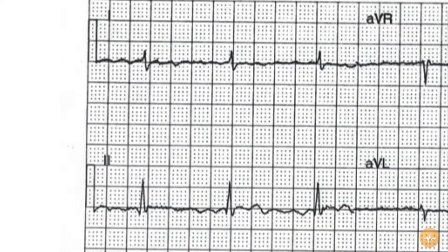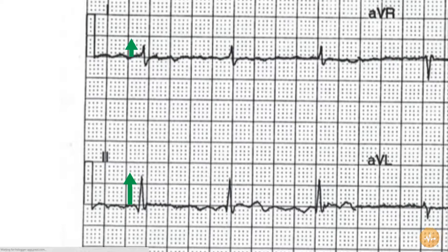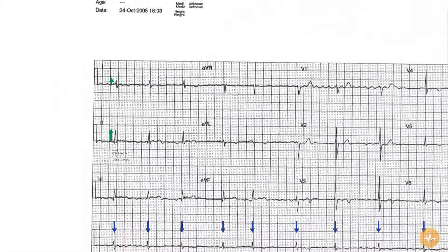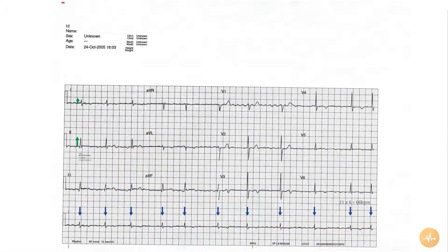The axis is normal, with an up-going complex in lead 1 and 2. The QRS duration is normal, at less than 3 small squares. There are no pathological Q waves present.